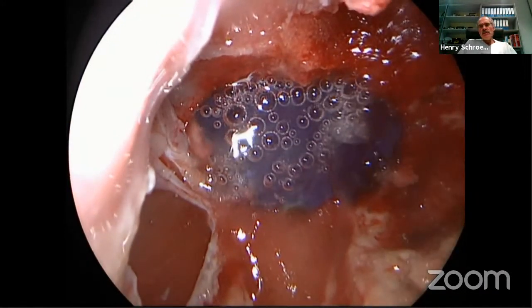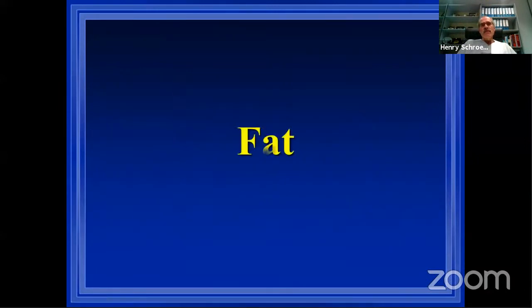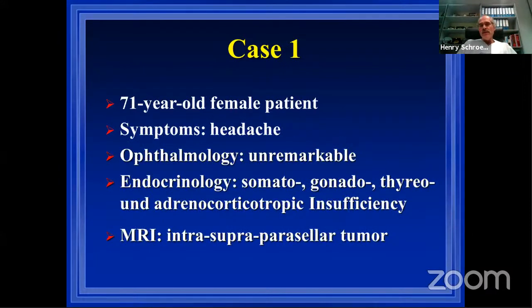I had a patient with also a very thin diaphragma sellae after resection, and I did not reconstruct much, just Gelfoam. So I did not reconstruct the bony sellar floor. And then he was sneezing shortly after extubation. Then a fountain of CSF came from the nose. So I think it's good when we have a reconstruction of the bone to prevent this.